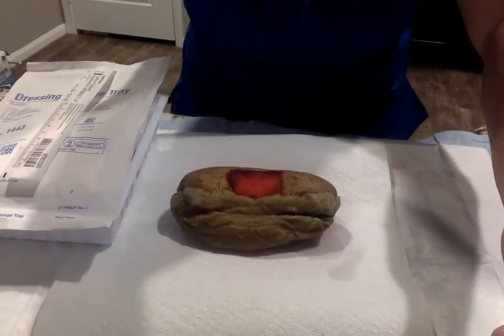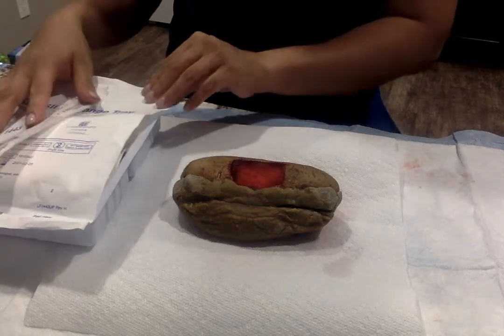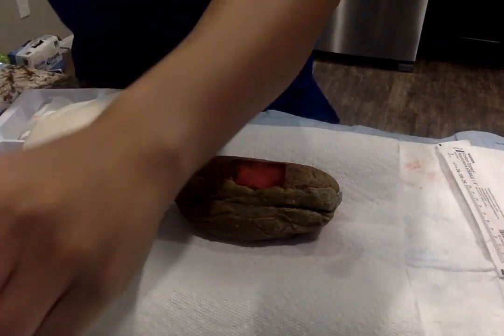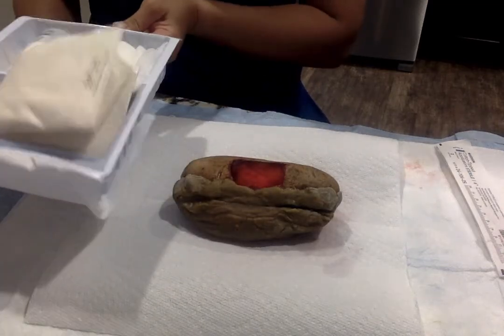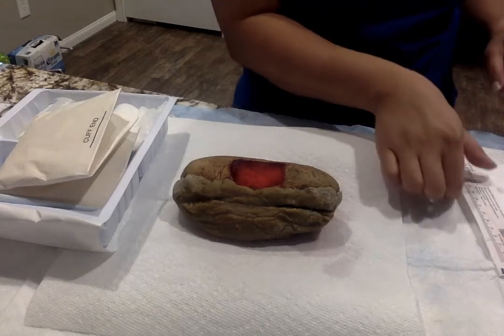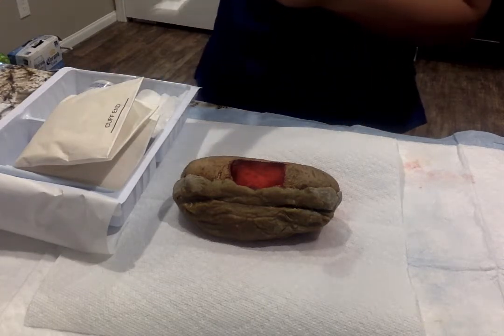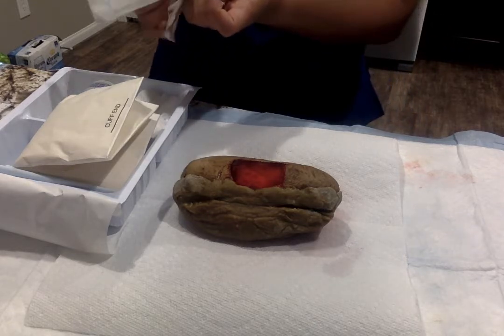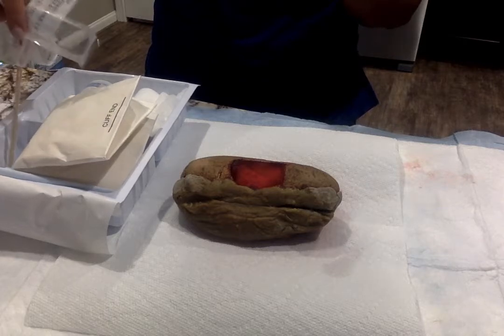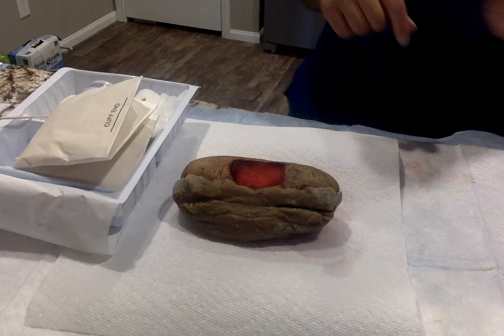And I'm going to go ahead and position my camera so you can see everything that I have here. Okay. So what I'm going to do first is open up my sterile dressing change tray, and I'm going to go over and under. I'm going to get my cotton tipped applicators and throw them inside of the tray. Hopefully it goes in without problems. Okay. And I'm going to grab my gloves.